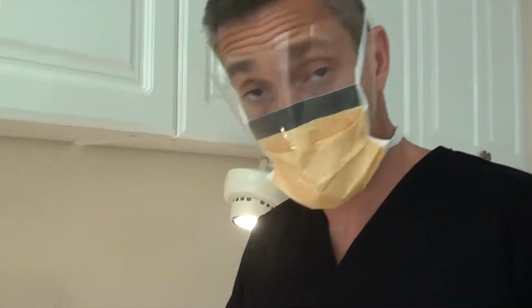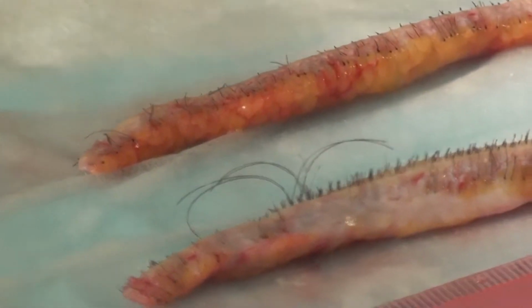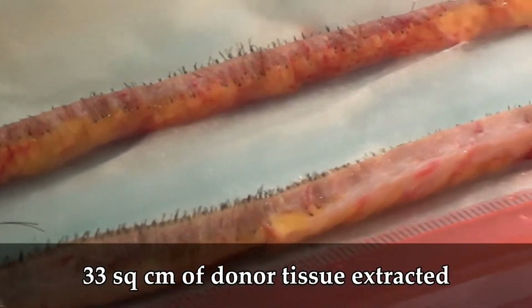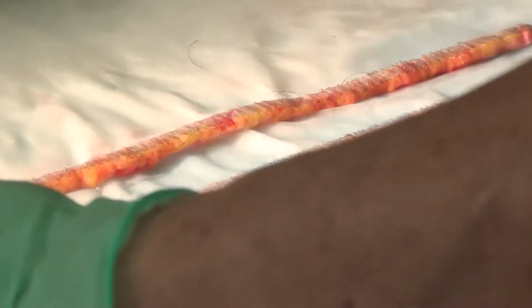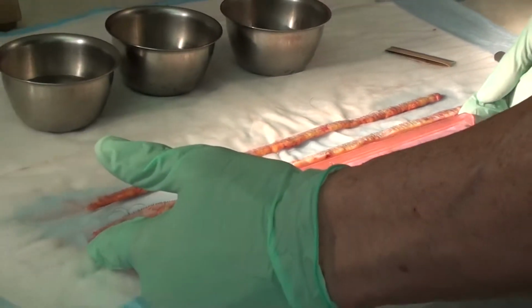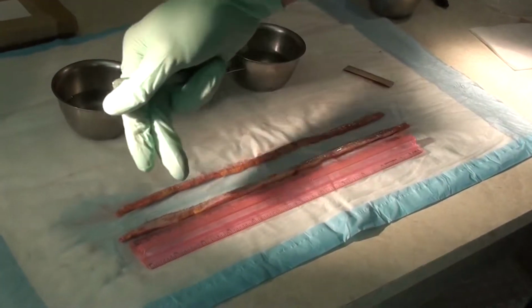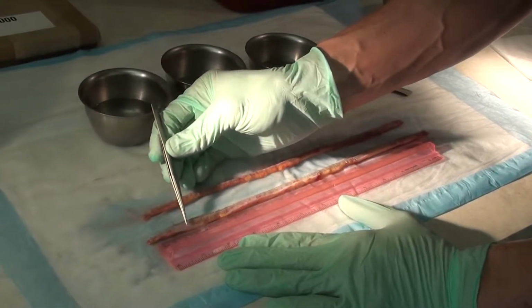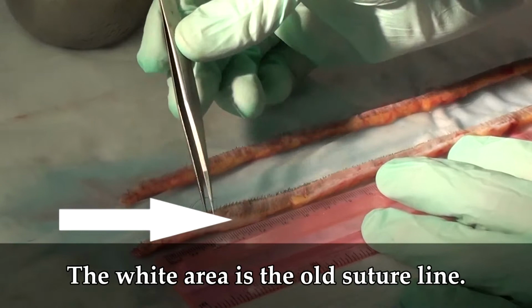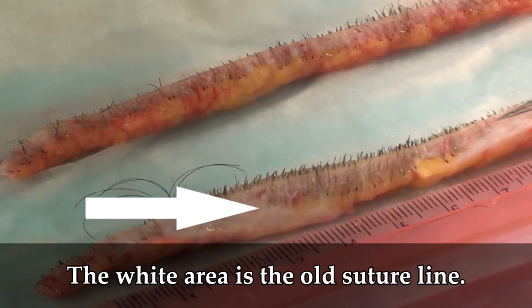Okay, so we just got through harvesting the donor, and what we did is we excised the entire old donor suture line out. We were able to pull out 33 square centimeters of tissue. As you can see here, this is a ruler, which is 12 inches, which is also approximately 30 centimeters. So there's 30 centimeters, then we have an additional about 3 centimeters on each thing. So each one's approximately 33 centimeters. Now when you take a look here, you'll see this little white area. The little white area is where we dissected out the previous suture line. So that's just some initial scar tissue.